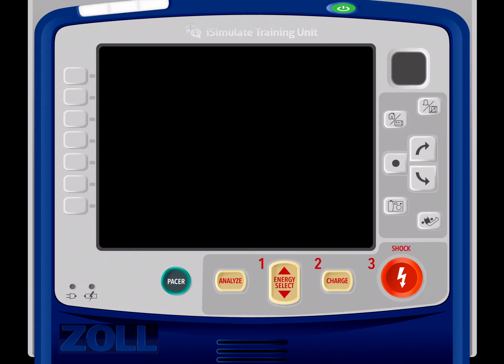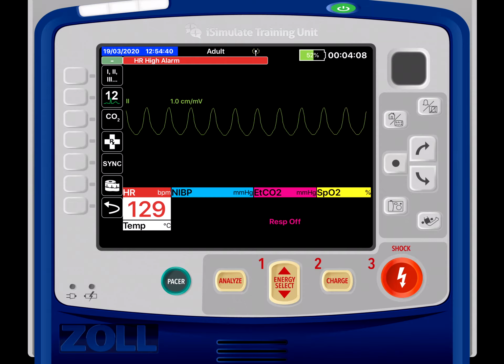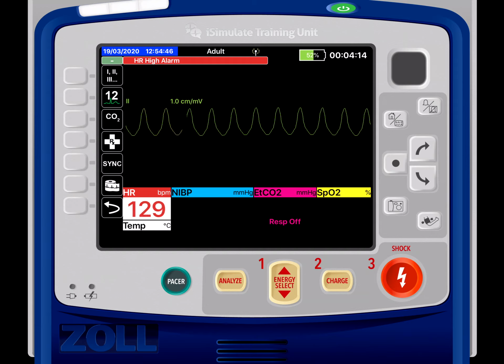So at this point, since it's a dynamic cardiology station, we should probably be dealing with the cardiac monitor pretty quickly. So we would go ahead and turn on our cardiac monitor and put a 4-lead on the patient and see what we get from this. Alright, so immediately upon turning this on, we see that we have a tachycardia. This is a wide complex tachycardia. It's regular, so we'd want to identify this rhythm as ventricular tachycardia, VTach with a pulse.